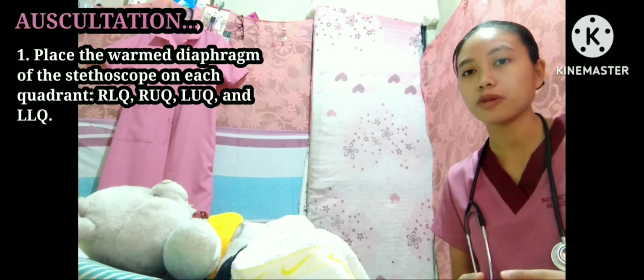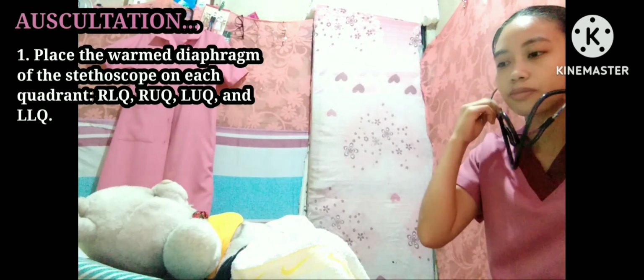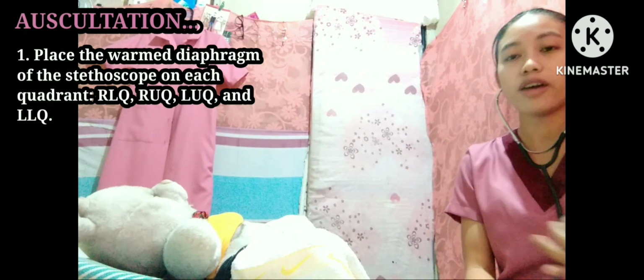So next I'm going to be doing auscultation, wherein I'm going to be placing a warm diaphragm of my stethoscope to each of the quadrants. So first I'm going to start with the right lower quadrant, then followed by the right upper quadrant, then left upper quadrant to the left lower quadrant.